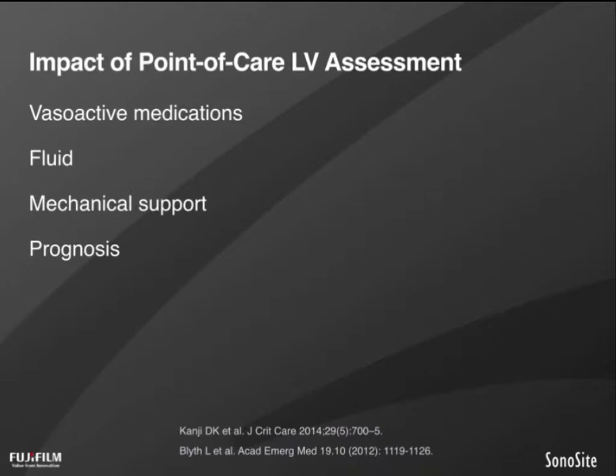Now, for acute care practitioners, the impact of understanding left ventricular function likely needs no introduction. However, it is important to stress that the left ventricle will influence many decisions you make as a practitioner for those in shock or respiratory failure, including the titration or initiation of vasoactive medications such as inotropes or vasopressors, the administration of IV fluids, the choice to implement mechanical support such as a balloon pump or ECMO, as well as prognostic features in multisystem disease.